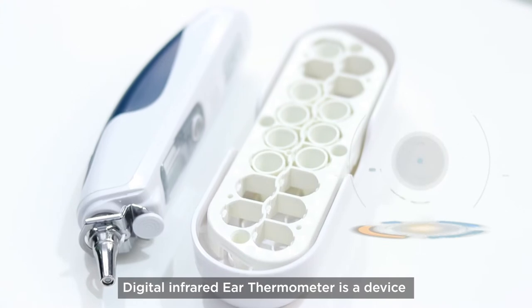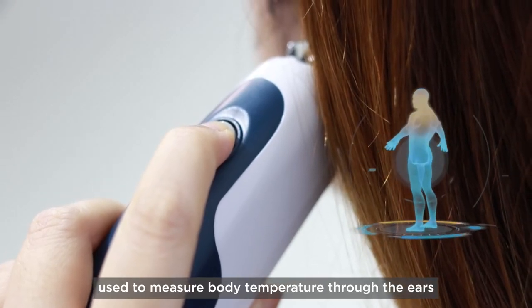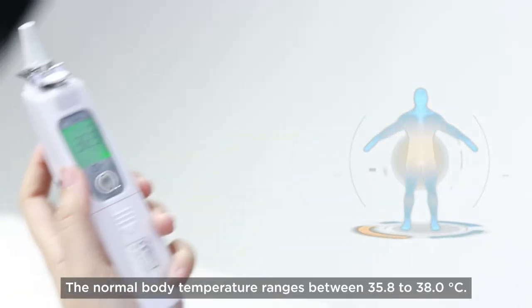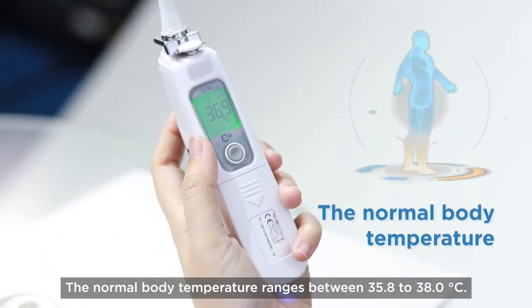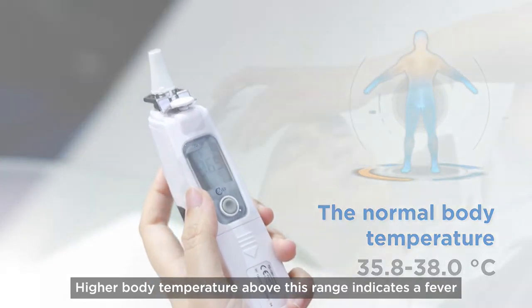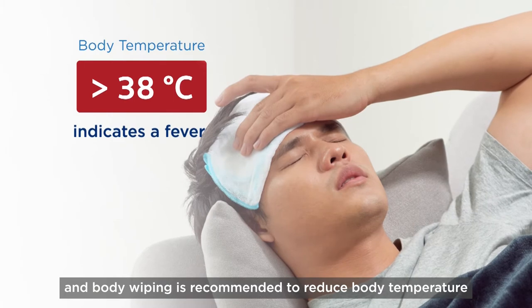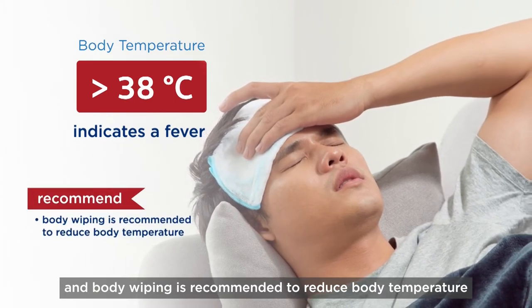The Digital Infrared Ear Thermometer is a device used to measure body temperature through the ears. The normal body temperature ranges between 35.8 to 38 degrees Celsius. Higher body temperature above this range indicates a fever, and body wiping is recommended to reduce body temperature.